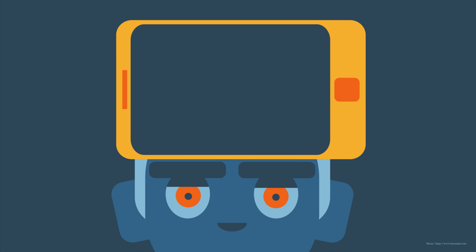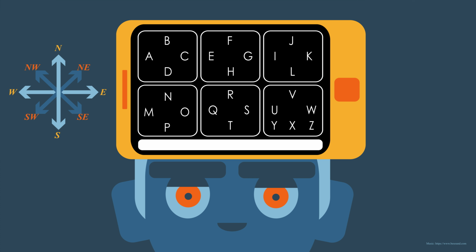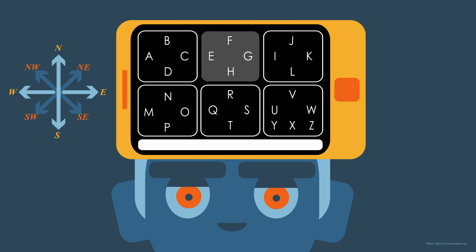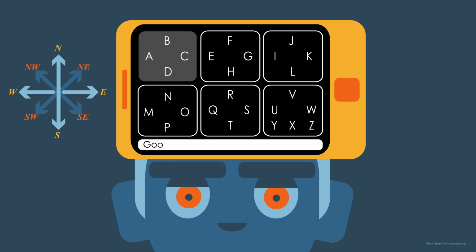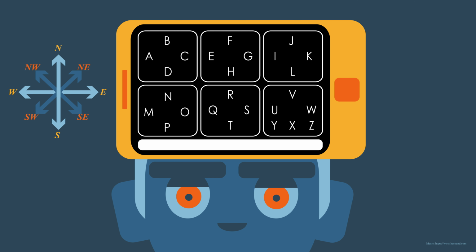The eye movements can be understood by the directions on a map as shown. The movement of the eyes is from the perspective of the user, and the keyboard shows the process of word formation, or what can be called typing with eyes. The software is also synced with predictive text that learns from the user's talking patterns and recommends words to make the process of communicating much more efficient.